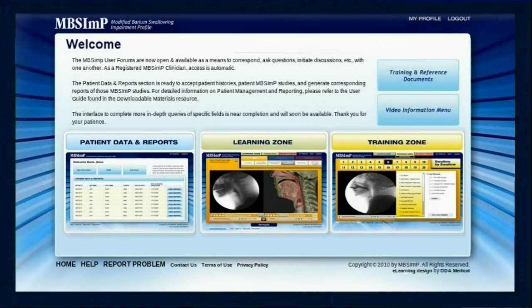Here, registered MBSImP clinicians have access to a collection of web-based tools that can be used daily to store and manage individual patient MBSImP assessment and treatment data in a secure HIPAA-compliant database. To automatically generate standardized, editable MBSImP study reports that can be imported into most electronic medical records.